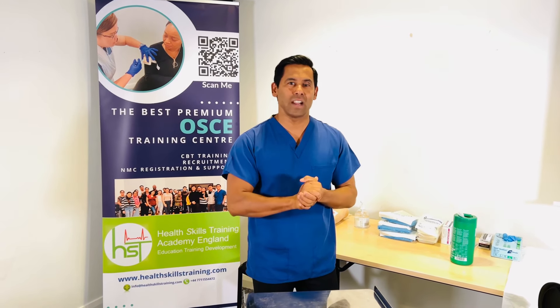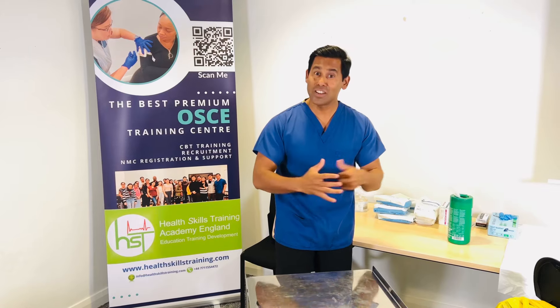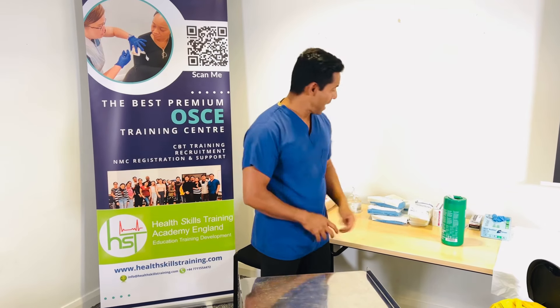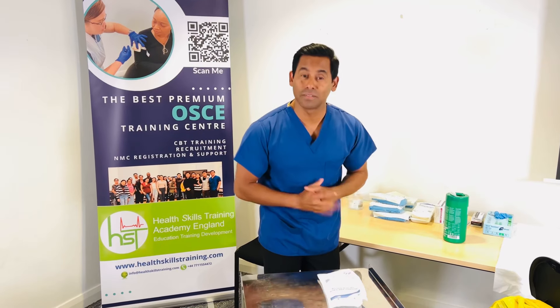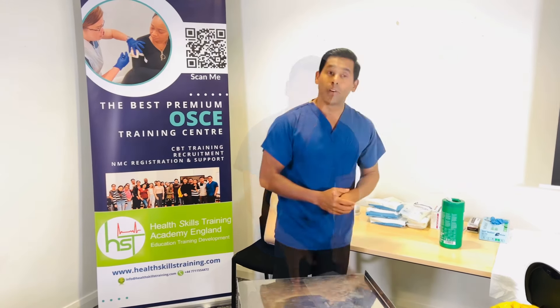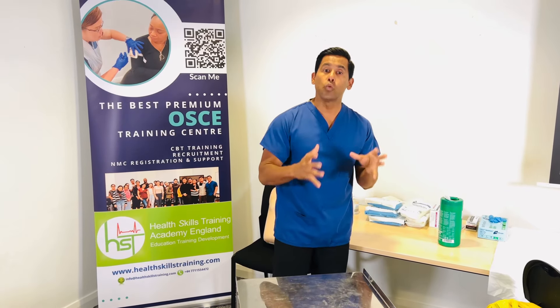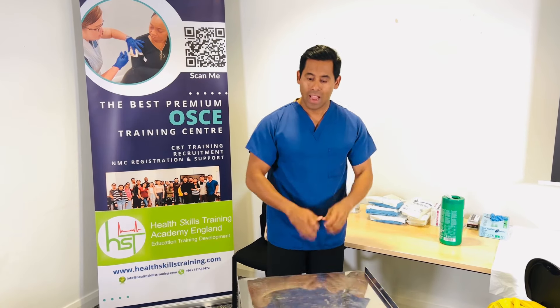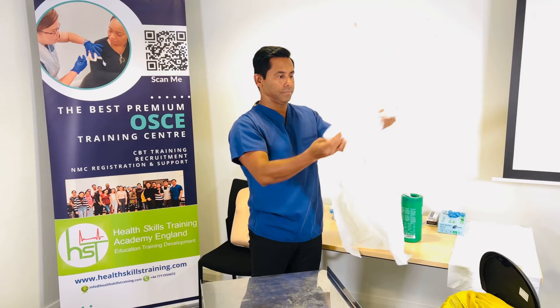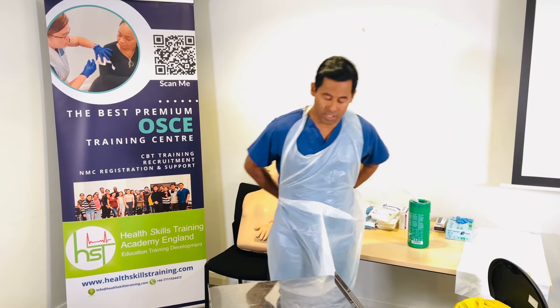When the trolley is available, is it clean and ready to use? Have you cleaned it? Many of you might forget to give it a good clean and directly place equipment on the top shelf — that is a common error. First, let's talk through each step to avoid these errors. Number one: you have to wear the apron and gloves, and then clean the trolley. Obviously, you clean your hands first when entering.